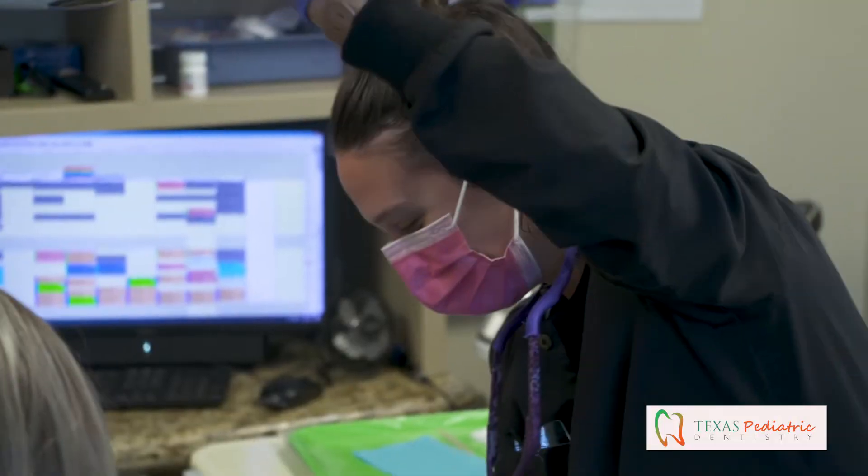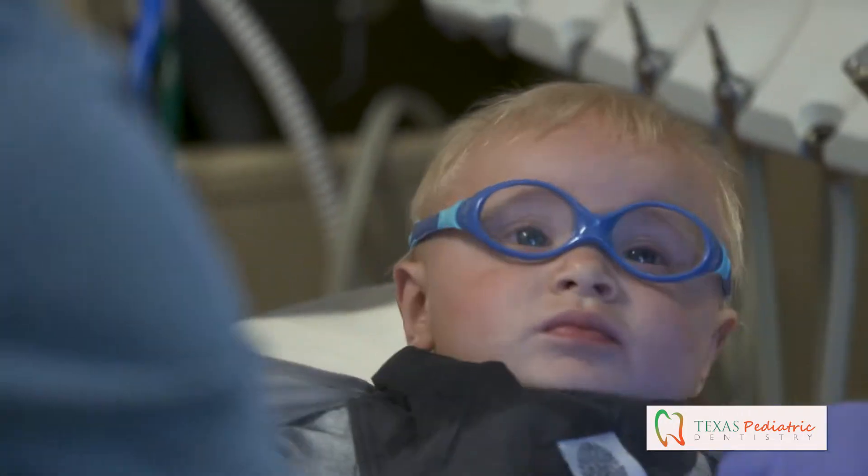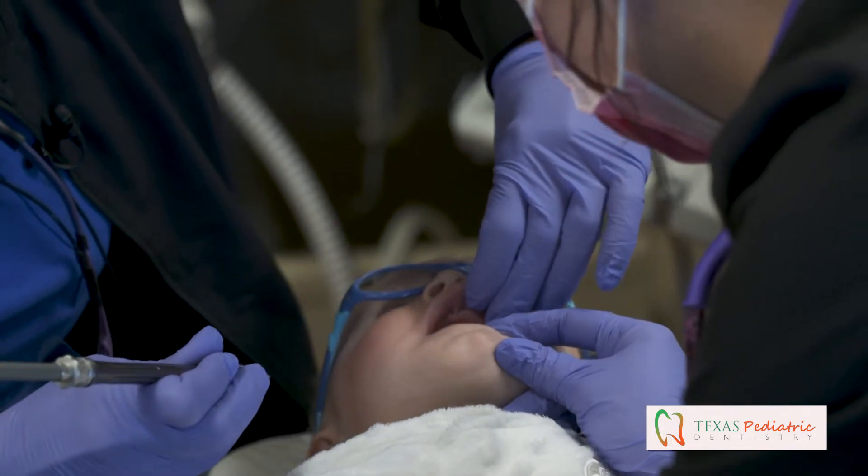It's quick — zip zip — and they're usually back to mama within 10 minutes max. They don't have to be put to sleep, which is a great benefit with the CO2 laser because it's so fast. They're with us a maximum of 10 minutes, so it's a pretty quick procedure.